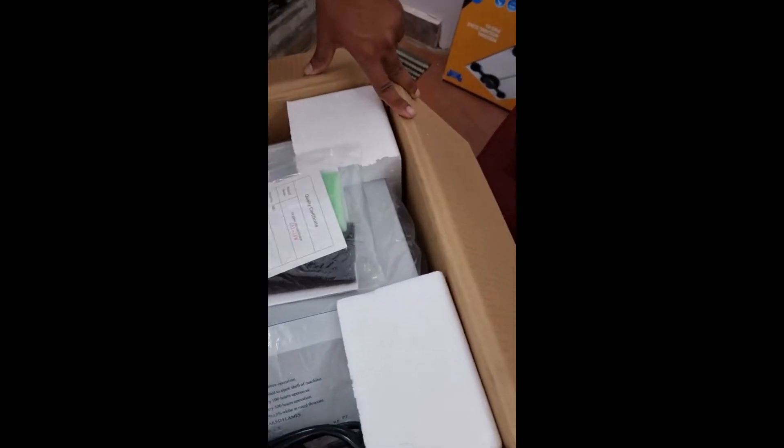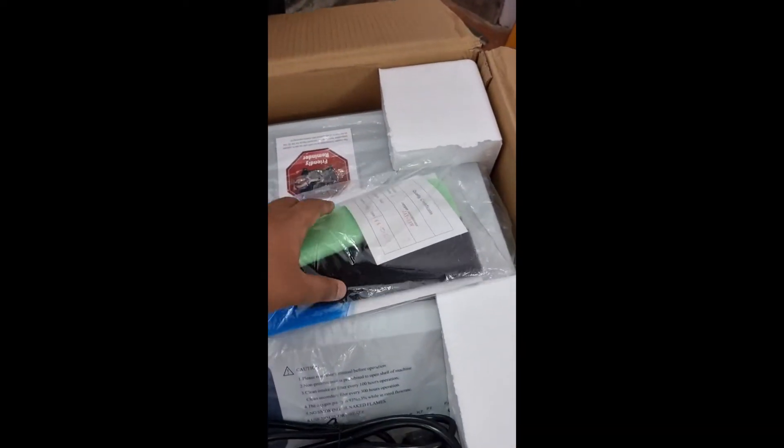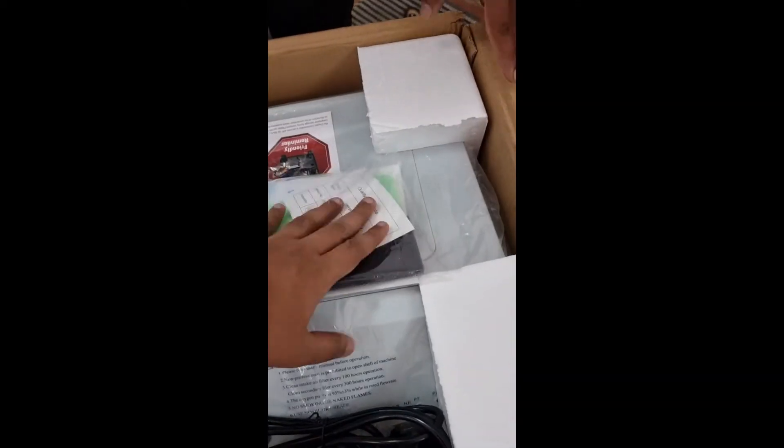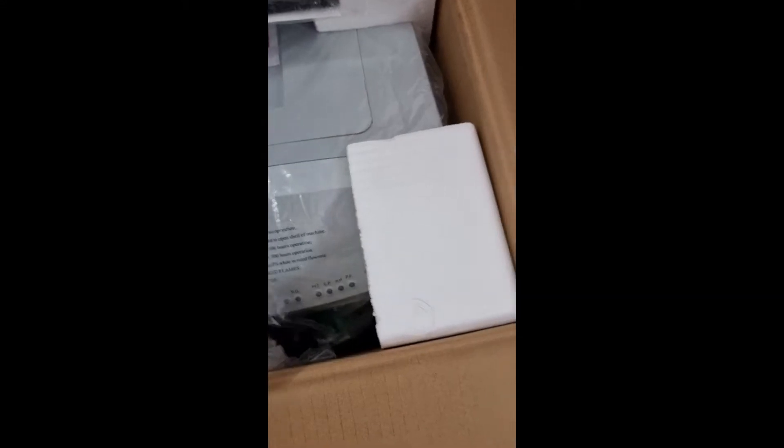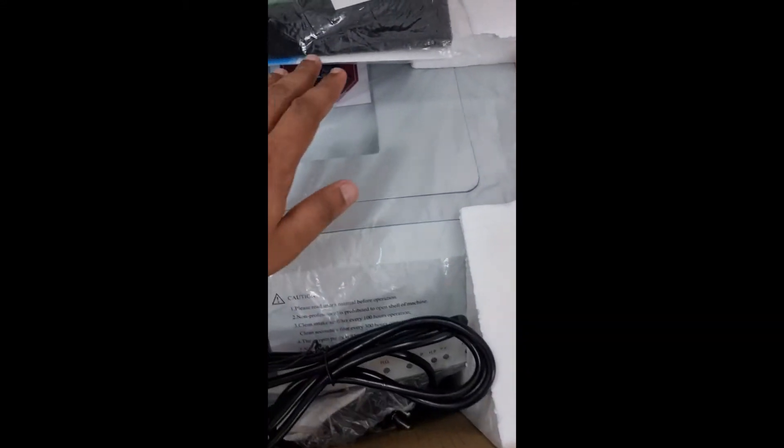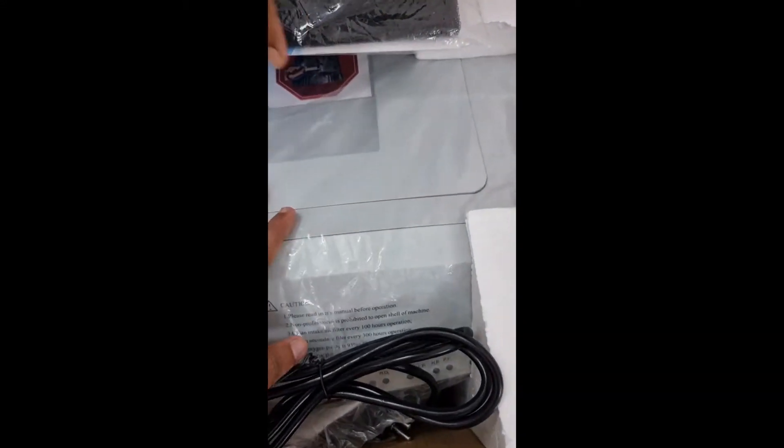It is almost 30 kg in weight, so be careful to handle the product. Once you remove the carton box, you can see the manual along with extra filters, and a test certificate. There is the power adapter, and the rest of the attachments will be inside this box.